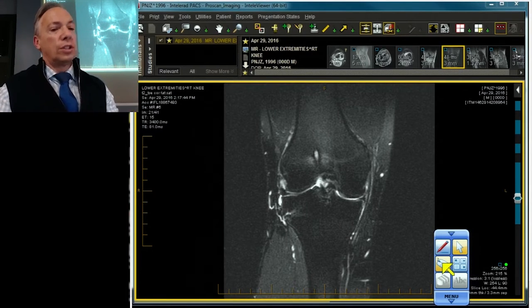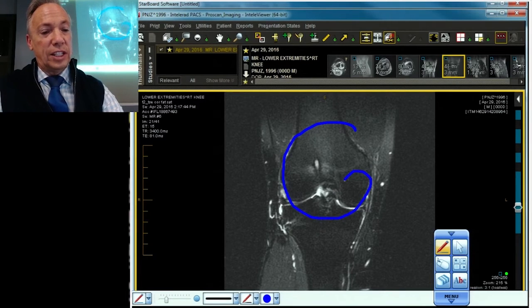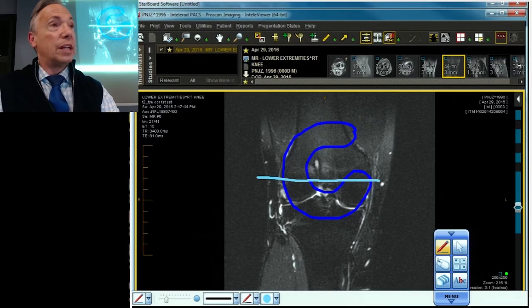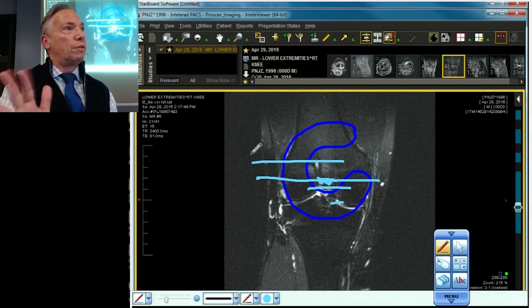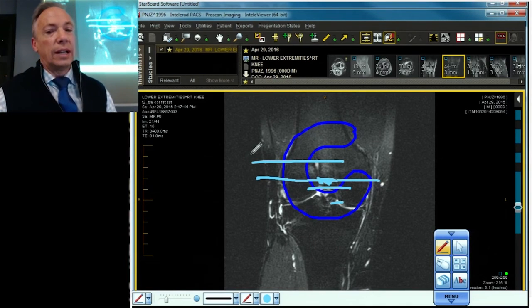The other major cause of misdiagnosis is a discoid meniscus. If you have a very tightly C-shaped meniscus and perform a coronal projection, on at least a couple of cuts you're going to get a meniscus, then a hole, then a meniscus. But that hole is just a normal curve — the normal cartilage surface. With a little synovitis, it might have a little fluid, looking like a hole. Then on the next cut the same thing appears but suddenly goes away, looking normal again. You go up to the next cut and all you see is a triangle — it never separates for more than two cuts. So a very tight C-shaped meniscus can simulate a bucket handle tear.